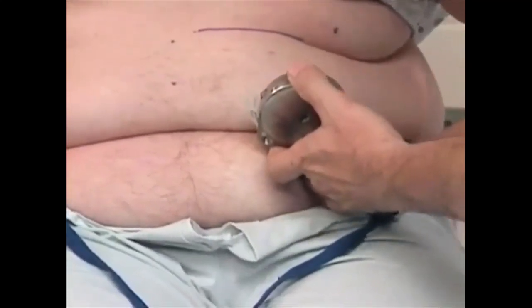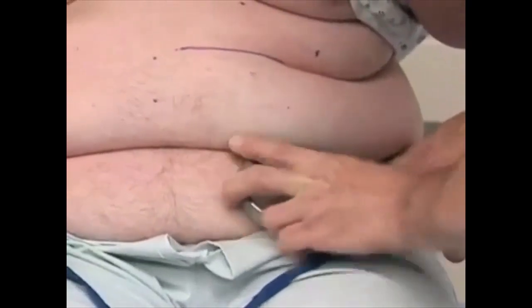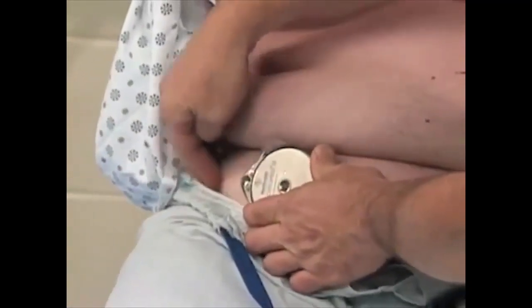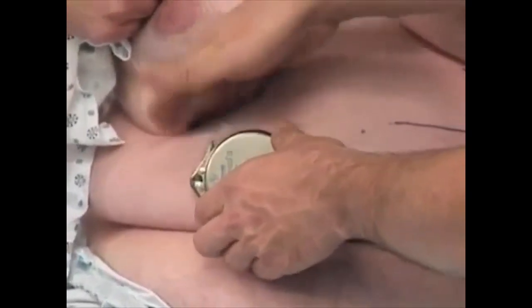Over here is his iliac crest, and again you have to be very careful that the pump doesn't rotate against the iliac crest. And if we mounted it on this side, again, the side port, you have to be very careful that the side port doesn't rub against the iliac crest. The other side is actually perfectly acceptable to mount it, but again the markings have to be in the same manner.